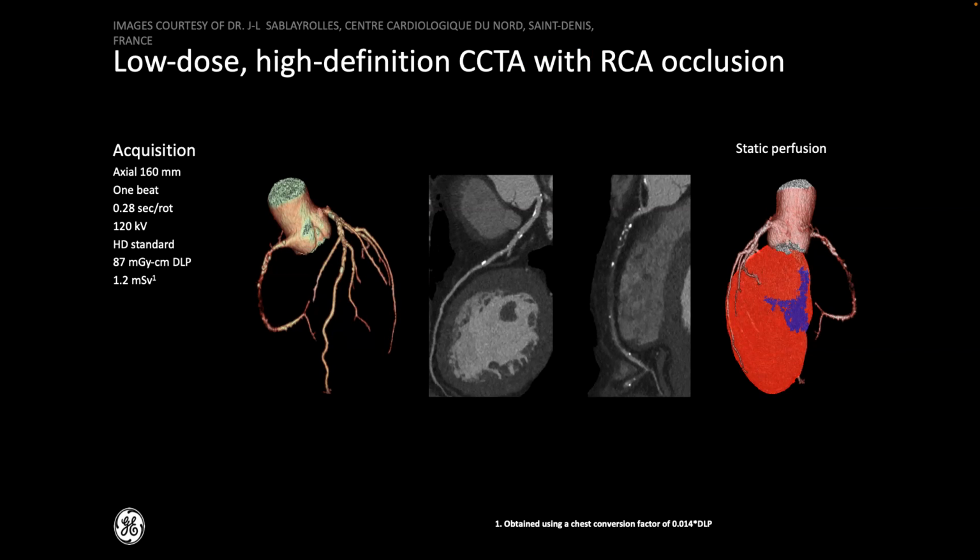And you have the issue that I really want to catch the stationary point in the heart cycle. So I'm going to scan the whole R to R and I'll pick out the best point. That gives you a scan that usually in most people is about 4 millisieverts of radiation, right? And if you want to do it for less, you want to get down to 2, get down to below the background radiation. So that's about 3.5. You want to drop your dose.